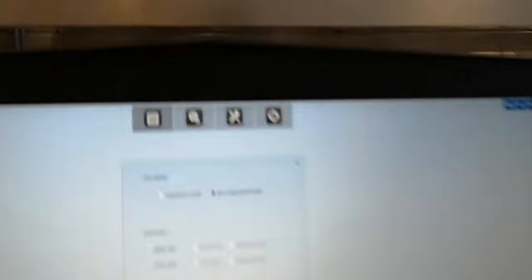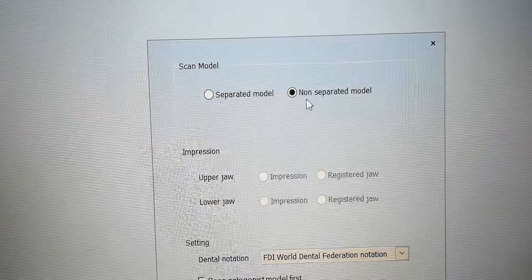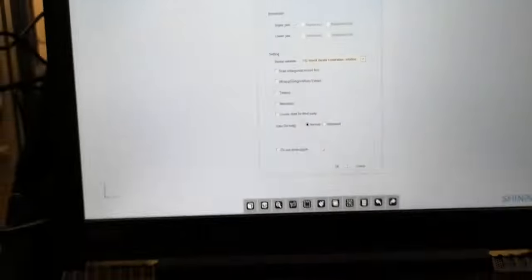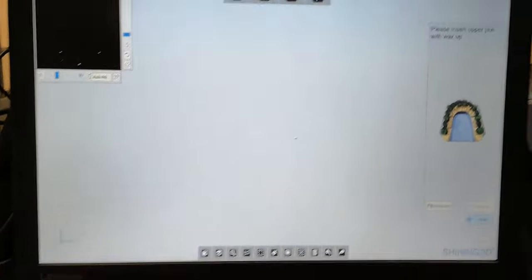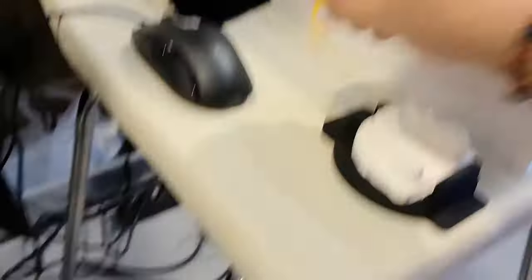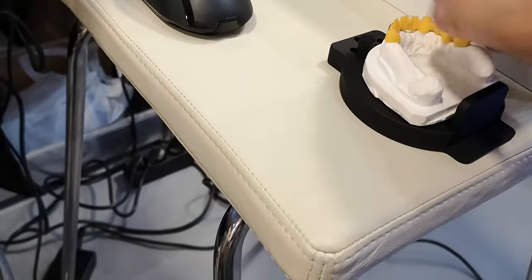I just marked here that it's a non-separator model. Let's see what they'll ask. We ask for wax up, let's put a wax up and do the scan.